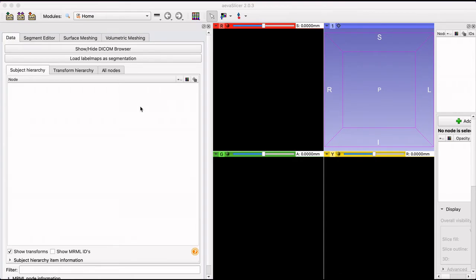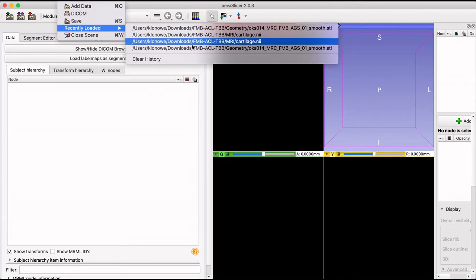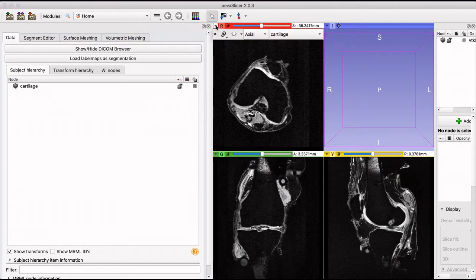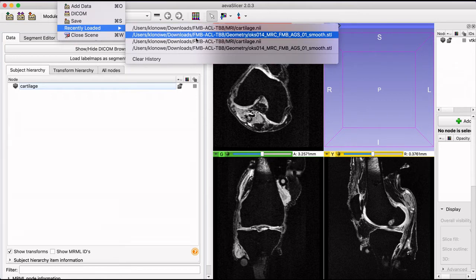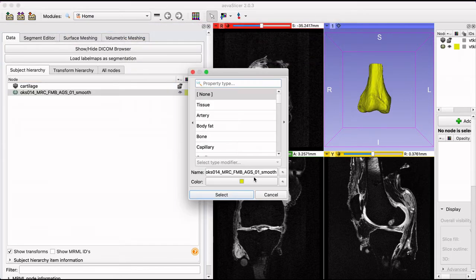This video will show the screen capture feature of AvaSlicer. The screen capture feature is useful to export images from the software using various formats and views. In this scene we have an MRI volume and a femur bone to use as an example.